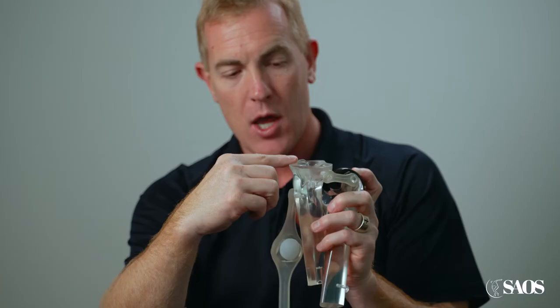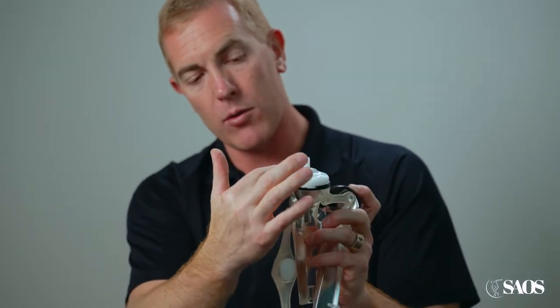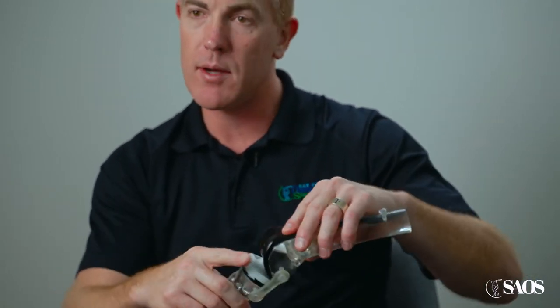On the shin bone side, this is showing the same thing — we trim up that surface bone and we have an implant with this little fin that goes on the inside, and then a little polyethylene or plastic spacer. So when it's all said and done, that makes up your new knee replacement.